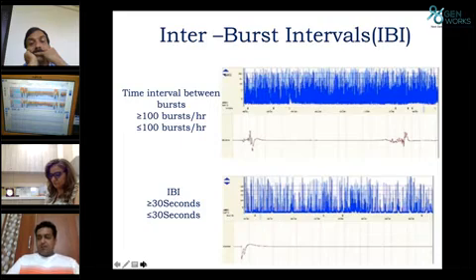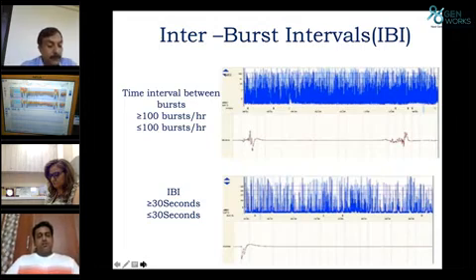And as rightly pointed out by Dr. Dinakar sir, it is better if we have the images saying what kind of premature child we are dealing with. We need to have a pattern of a 26 weeker, where we have already seen the discontinuous pattern. If the discontinuity is more compared to a normal 26 weeker, then we have to suspect intraventricular hemorrhage in such neonates. Just comparing it to a term child or a 30 or 31 weeker, the significance of intraventricular hemorrhage will be lost in these neonates. Thank you, Prashant. Over to you.